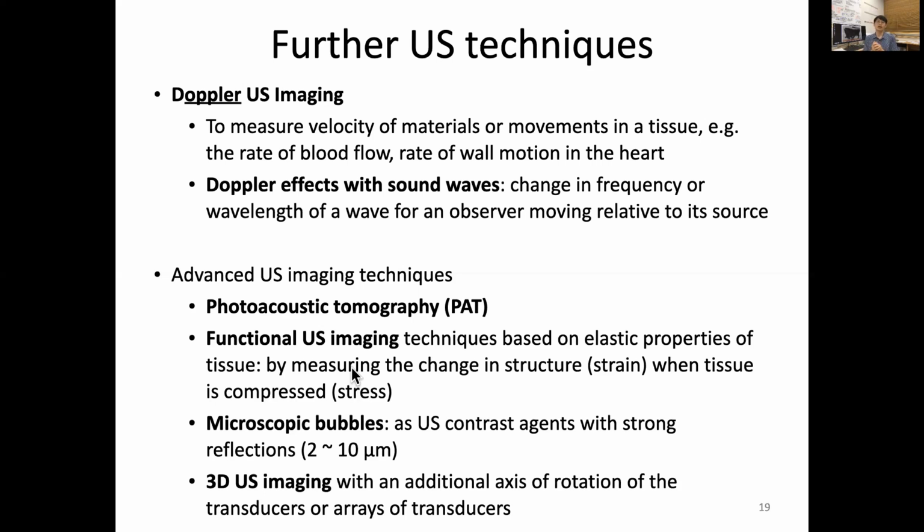And also, like X-ray, ultrasound can have a contrast agent, which happens to be a microscopic or nanoscopic bubble, about 2 to 10 micrometers in diameter.